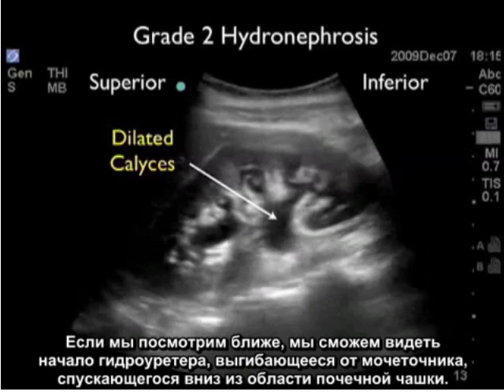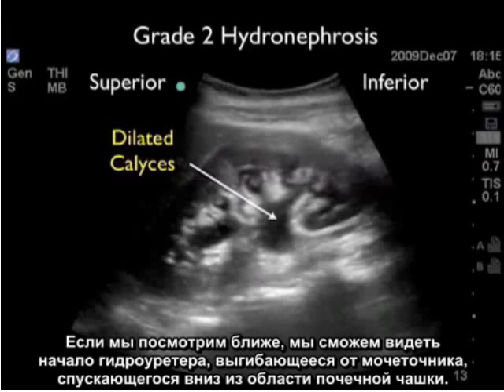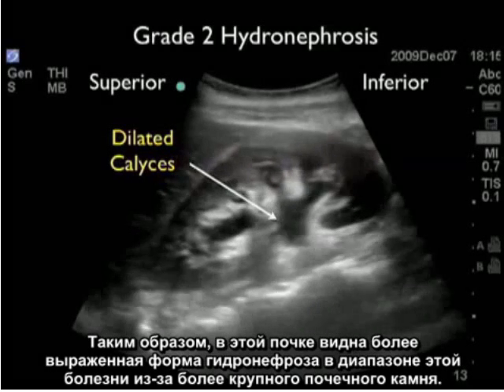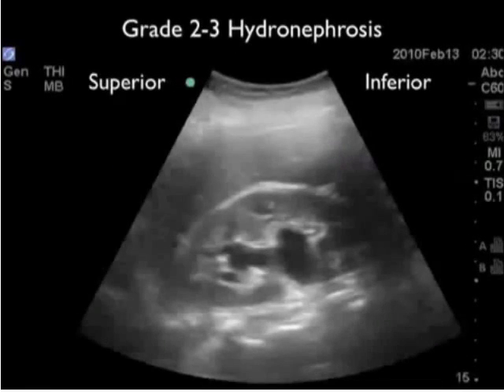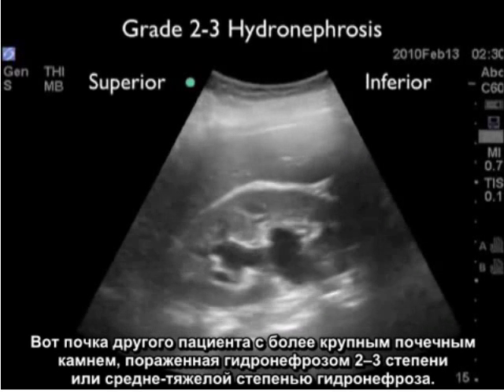And if we look closely, we can see the beginning of hydroureter, the arching away of the ureter coming down inferiorly away from the calyceal region. So a more pronounced degree of hydronephrosis on the spectrum of disease seen within the kidney due to a larger kidney stone.